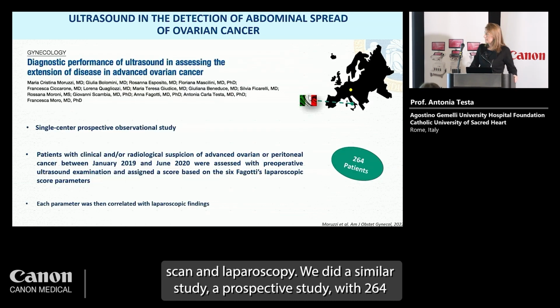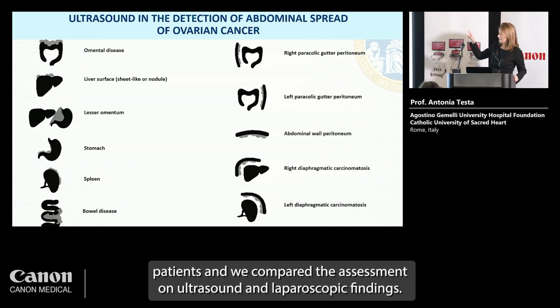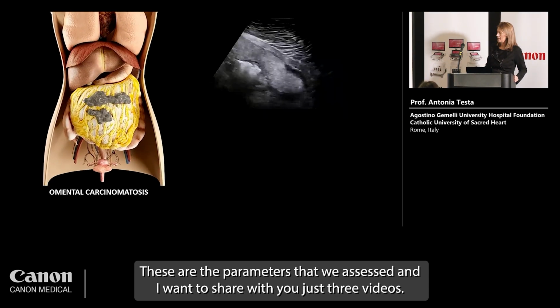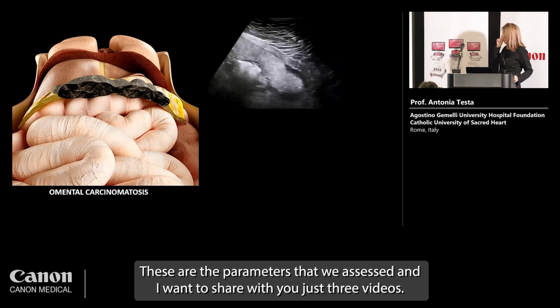We did a similar study, a prospective study with 264 patients, and we compared the assessment on ultrasound and laparoscopic findings. These are the parameters that we assessed, and I want to share with you just 3 videos.